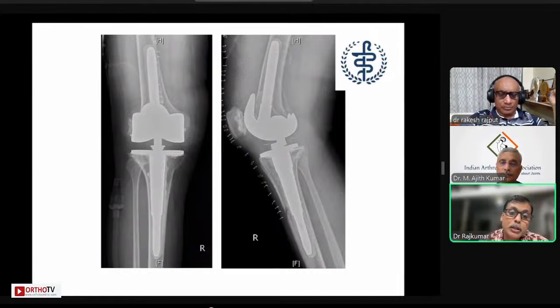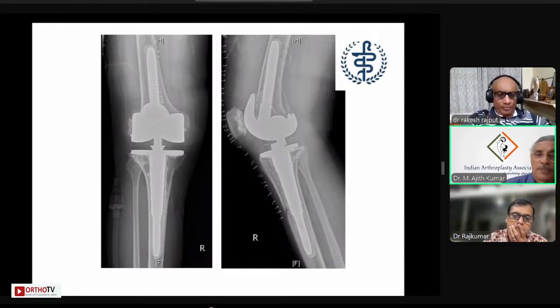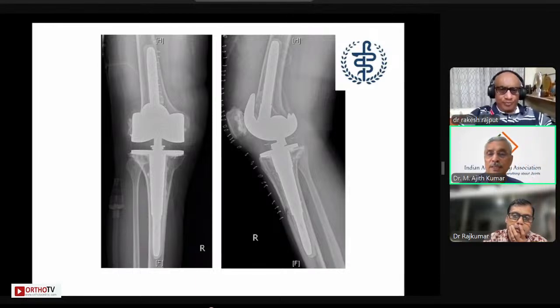So now anyhow, because you have used a hinge, you have used a stem which has crossed to the osteotomy side. If the hinge was not used, this osteotomy length would be a little tricky one because it would have gone a little far down. Yeah, but with the osteotomy, you don't see the implant. You still get the fit. It should be okay when you do the osteotomy. Anyway, good. Well done. Walking comfortably.